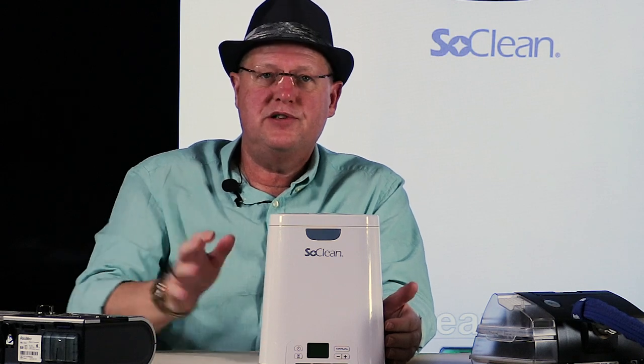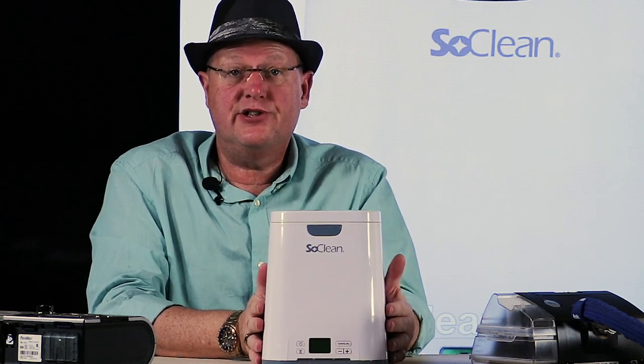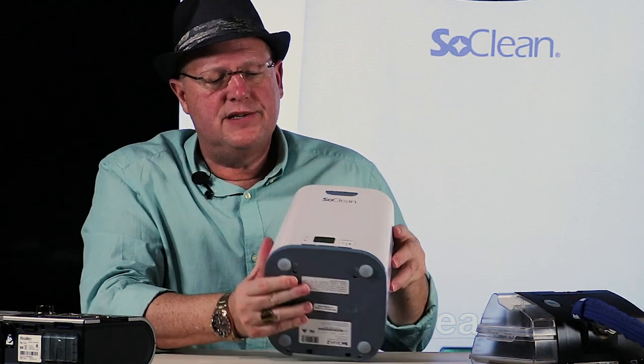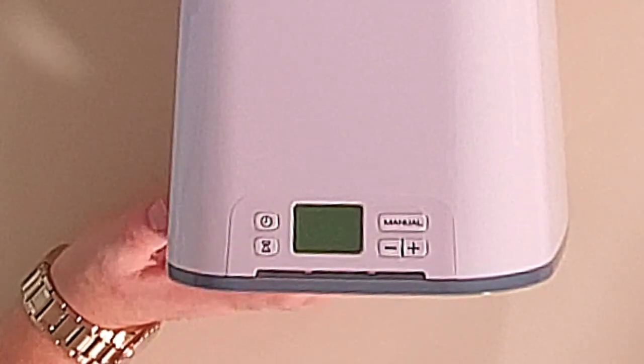When you receive your unit, you'll have a few parts and pieces. The SoClean itself is essentially just a big tank or chamber. At the front you have a very basic control panel — a button to set the time, another button for the duration of the cleaning cycle (they recommend seven minutes, which has worked great for me), and a manual start button. That's quite frankly how I use it; I don't use the timer since I don't use the machine every day.